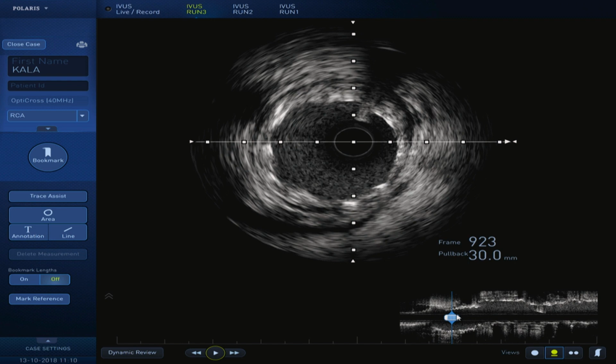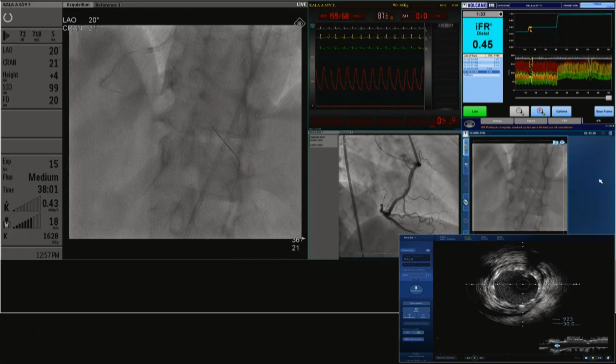And then once I get that, I agree with Pratap that that gives me a chance to at least get the IVUS up to the stented area. And you can see, despite putting a long stent and really bracing the RCA, the IVUS was not going down the bend. And that's because the stent now straightens the vessel.